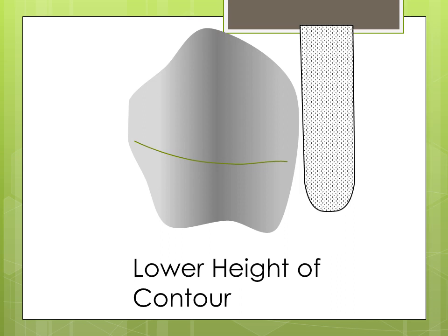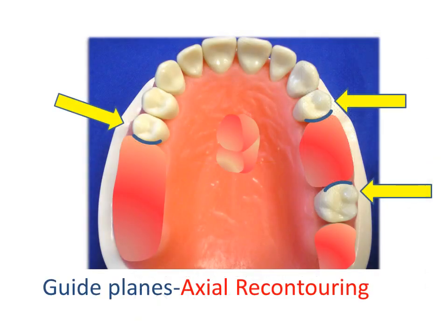Of course, the flexible retentive tip should be in the gingival one-third. For purposes of illustration, the guiding planes are in blue, and areas to be re-contoured are in red. One should mark these areas on the diagnostic cast.